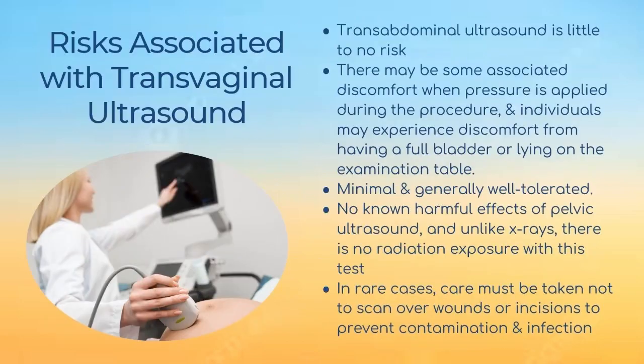Risks associated with ultrasound. Transabdominal ultrasound is little to no risk. There may be some associated discomfort when pressure is applied during the procedure, and individuals may experience discomfort from having a full bladder or lying on the examination table. It's minimal and generally well tolerated. There are no known harmful effects of pelvic ultrasound, and unlike X-rays, there is no radiation exposure with these tests. In rare cases, care must be taken not to scan over wounds or incisions to prevent contamination and infection.